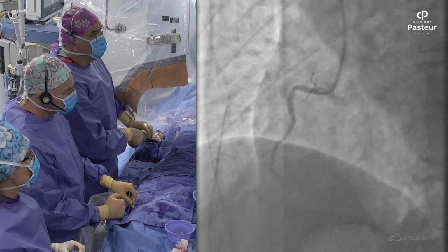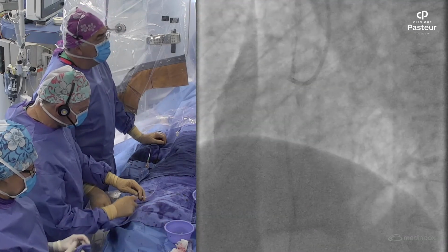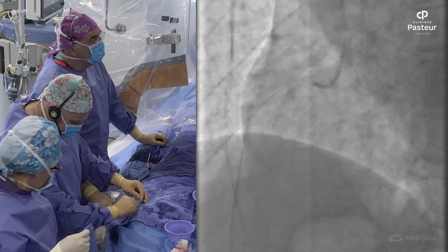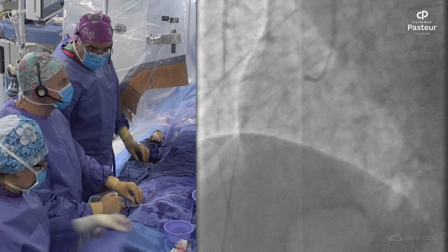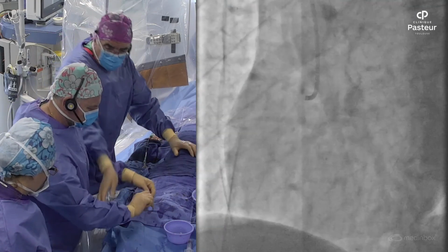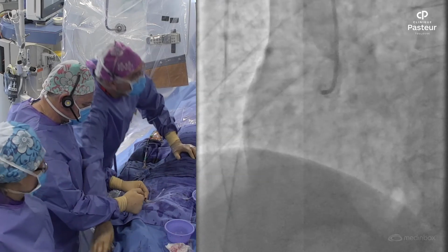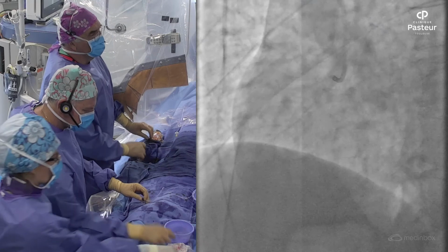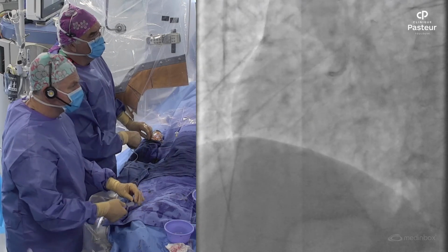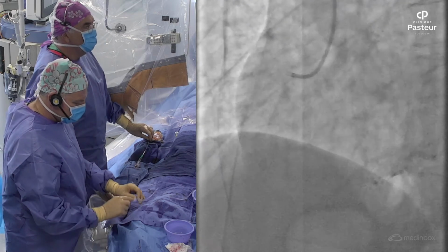Maybe it's not critical. We will take a view here. Nitroglycerin. Okay, pressure is good. So we can take some nitro. Ready?